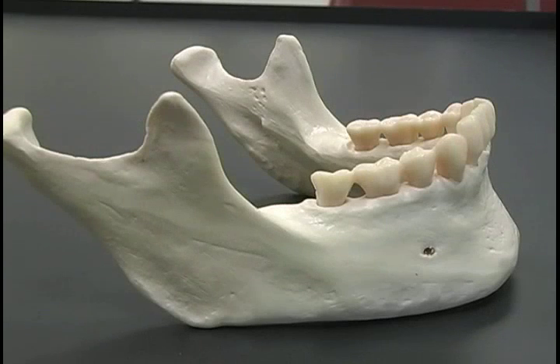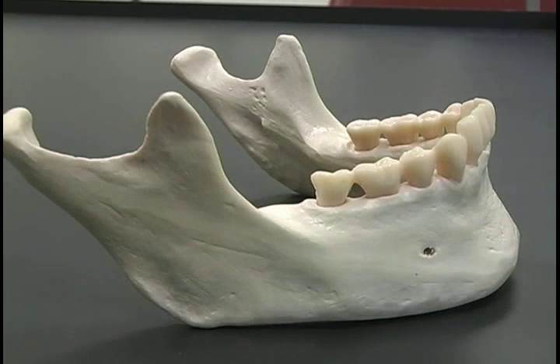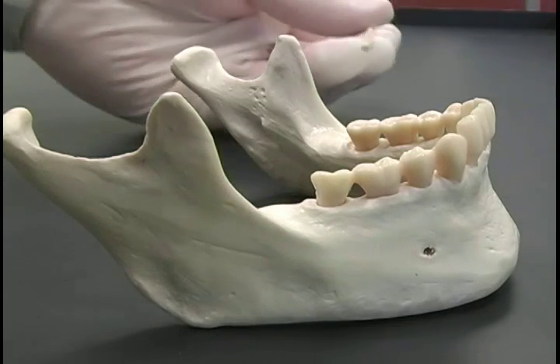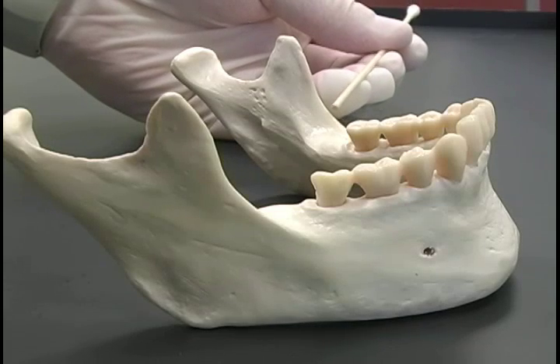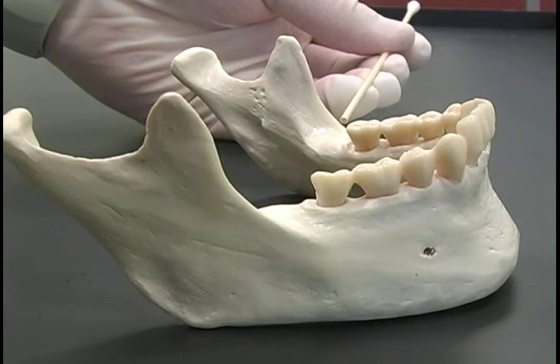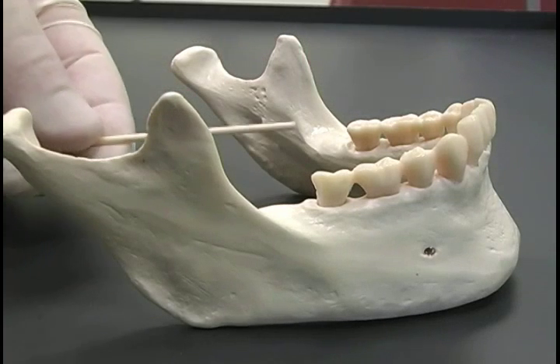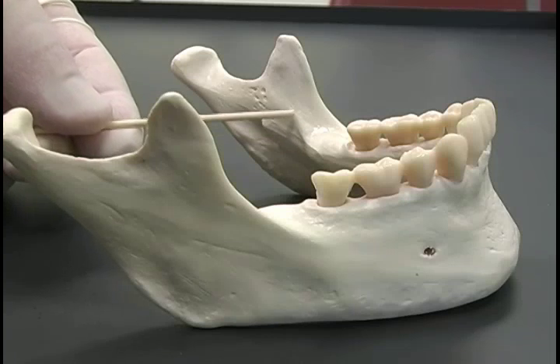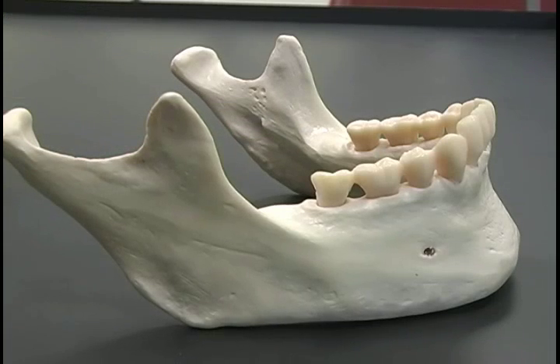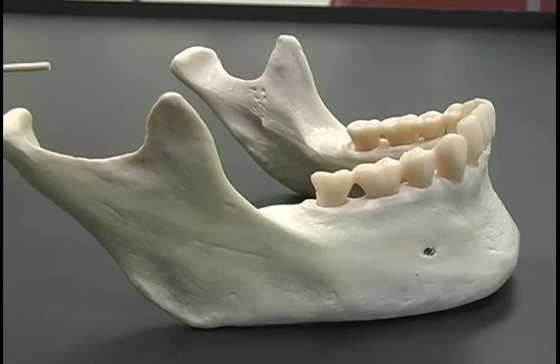When giving inferior alveolar nerve anesthesia, it is important to have good anatomical landmarks. An important anatomical landmark is the external oblique ridge, which can be found on every patient. The internal oblique ridge is much more difficult, and using the Raffae can sometimes lead to giving anesthesia in not precisely the right location.